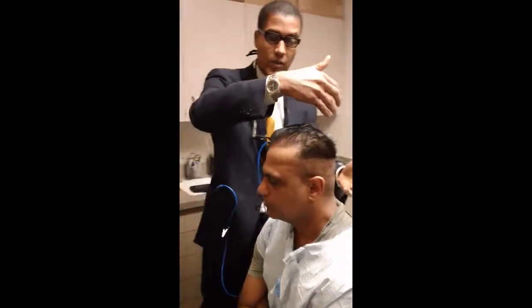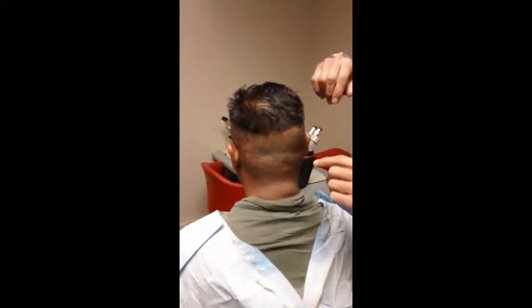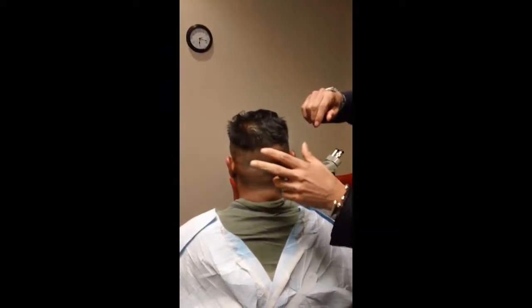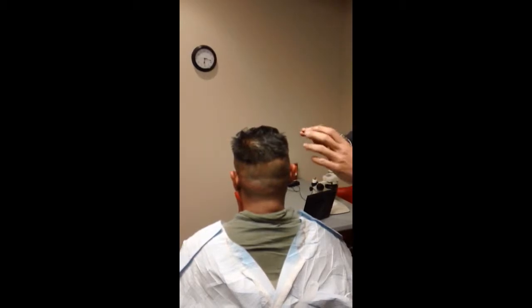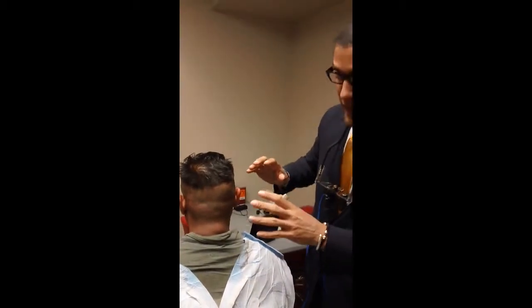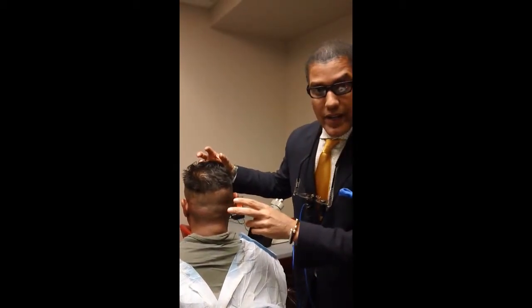If you can come around with the camera to the back, all the way around — we just went in the nape of the neck down here and got around a thousand grafts. He's had two procedures done before. If you can see back here, he's had a total of four thousand grafts, but his hair is shaved pretty tight and you can't even tell that he's had any work done. So he went down in the nape of the neck just to reinforce the hairline to get very fine hair.